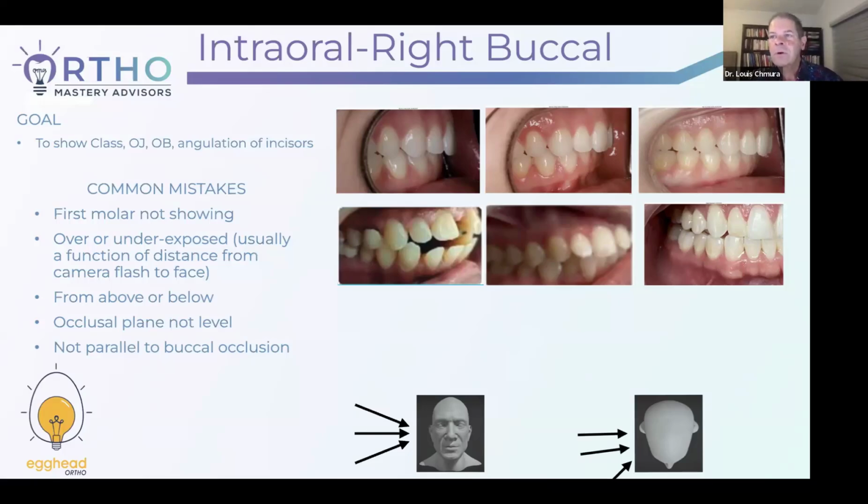Do I take the photos or an assistant? One person takes them, right? I designate an assistant to take them. I rarely took photos unless I knew it was a teaching case and I knew they had to be pristine, in which case I'd take them. I spent a lot of time and energy teaching my assistants, and they were really, really good, but not perfect. If it really, really mattered, I would do it myself.